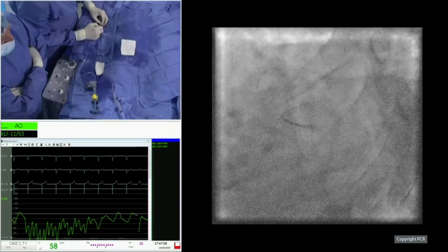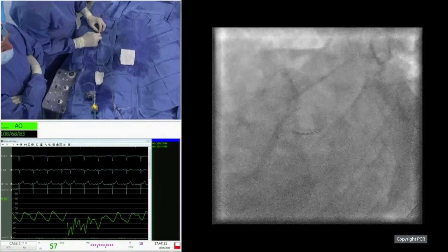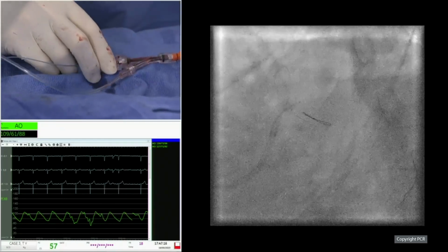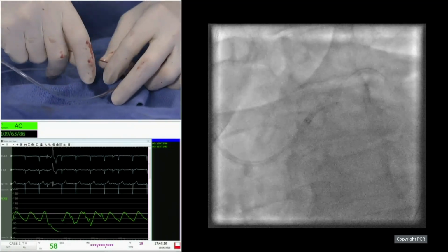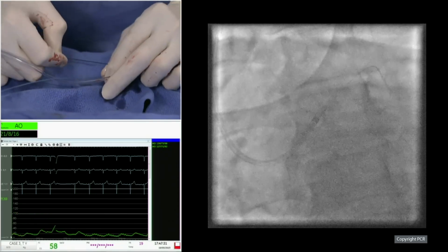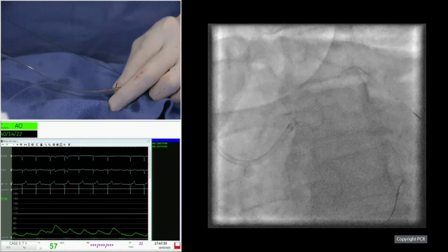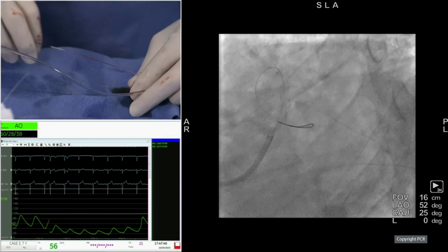One guess, if you want to make one guess, is that there may be some calcium protruding in the ostium of the circumflex. I think they decided to stent the ostium of the circumflex. The stent, side branch, is not crossing easily, so maybe you do not force. You have maybe to predilate a little bit more the ostium of the stent. So maybe consider going back to IVL in the ostium of the circumflex, given there's probably calcification.